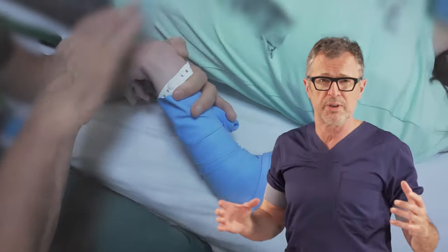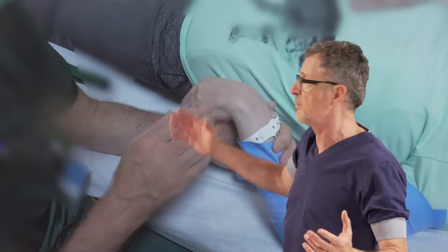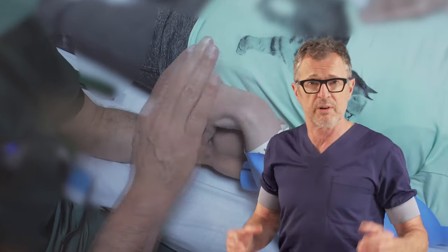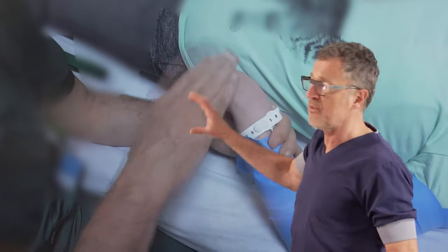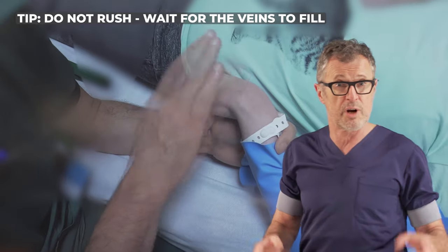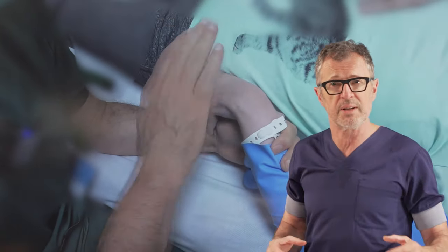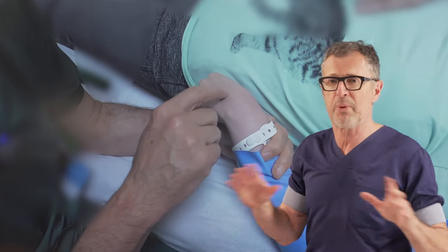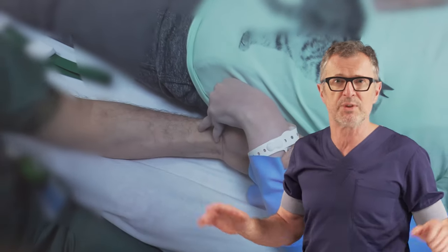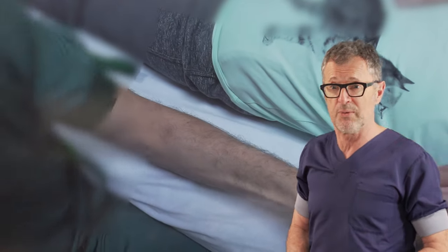It's a bit challenging because there's not much immediately showing up in terms of peripheral veins superficially, but you really have to arm yourself with patience. This is never a situation where you want to rush, because you have one chance, one time, to gain their confidence and try. The very first time you fail, everything that you have planned and prepared may break loose, and you're going to lose the patient's and their parents' confidence.